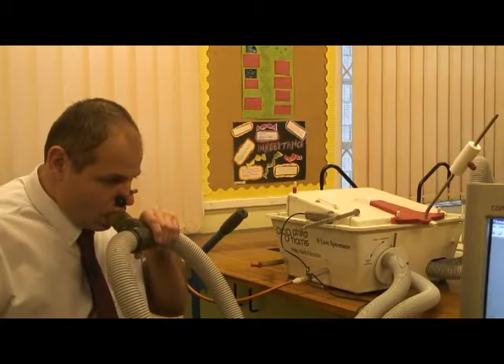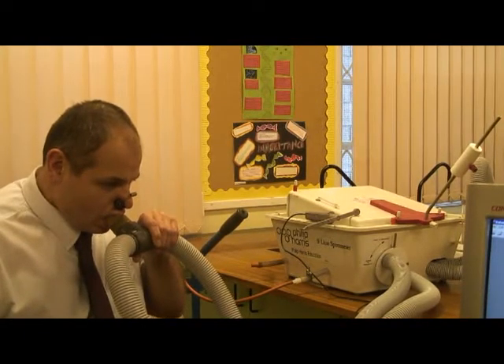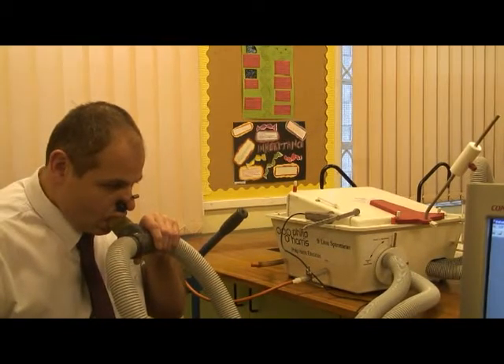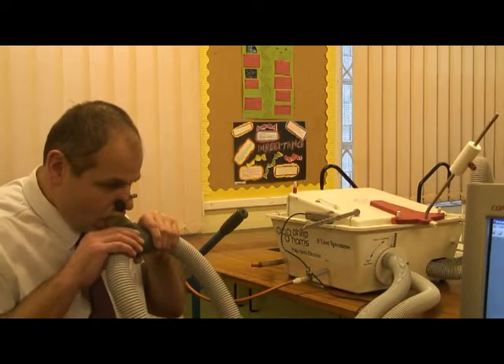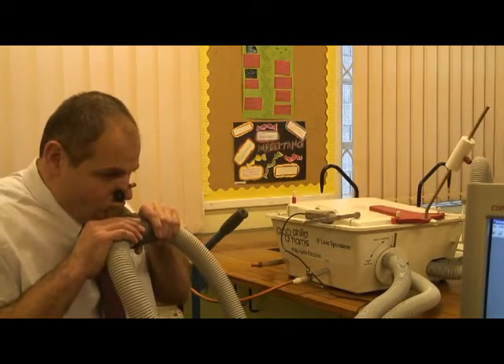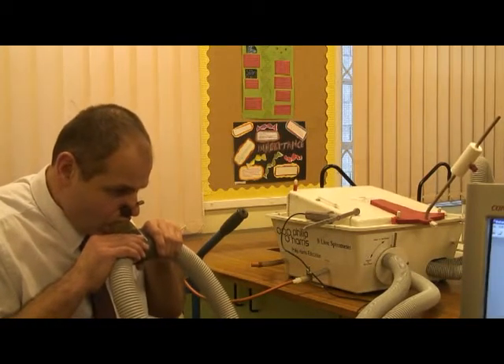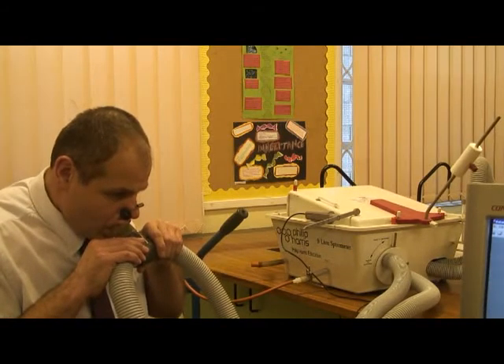Here's the subject breathing gently in and out. You can see the spirometer lid. Those lid movements are translated by the movement sensor — again the grey apparatus — and you can see that moving up and down very vigorously now as the subject takes a deep breath in and a deep breath out.